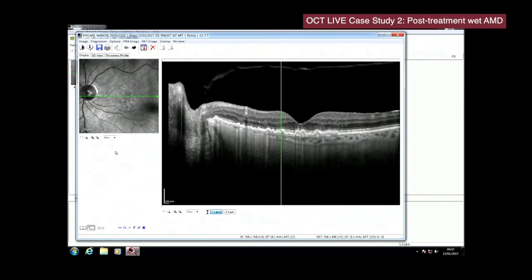I think if you can monitor the patient with serial OCTs every month or every 2 months, they can monitor it. And if you see any recent hemorrhage at the macular area or some subretinal fluid or intraretinal fluid, or if the patient themselves complains of any distortion, then that means something is going on.